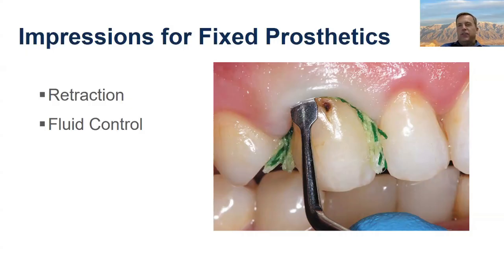So you kind of have to decide what you can get away with in your practice, but make sure that there's a visible gap at the margin, because that's going to make your fit so much better. That's how you'll get those sweet x-rays where you see the margin just blend perfectly to the tooth.